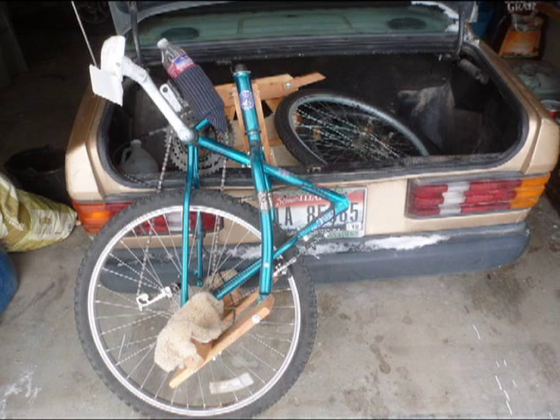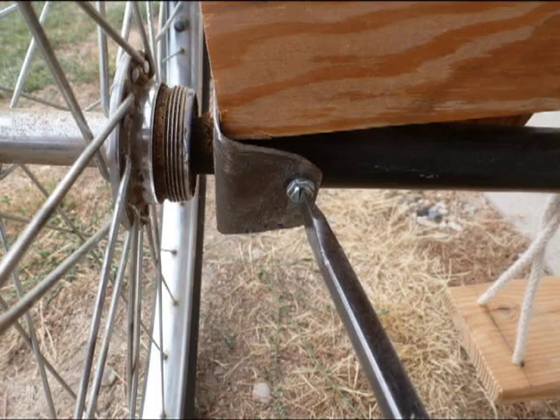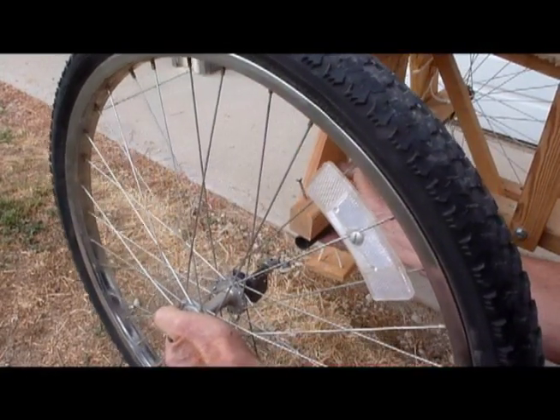Your ride is light enough to load whole, or by removing two screws the OBOW-R wheels come off for easy transport.